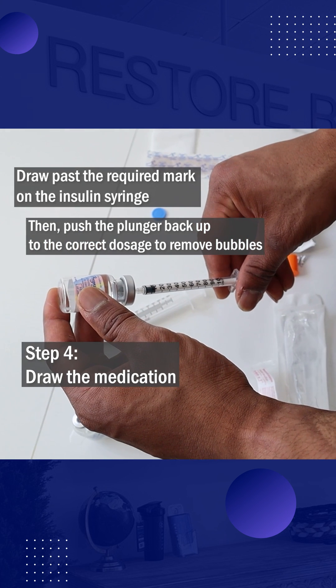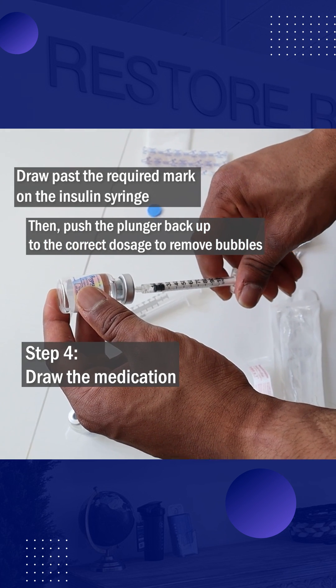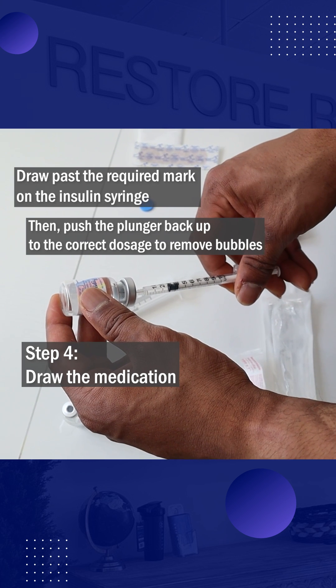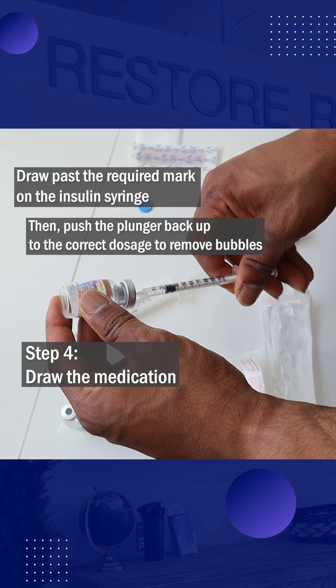Draw past the required mark on the insulin syringe, then push the end of the plunger back up to the correct measurement. This will allow all bubbles to be removed from the syringe.